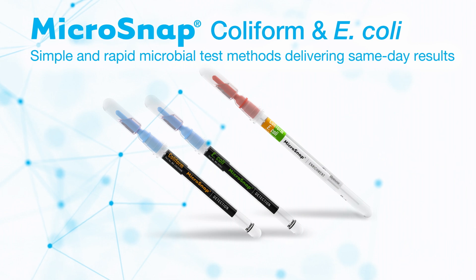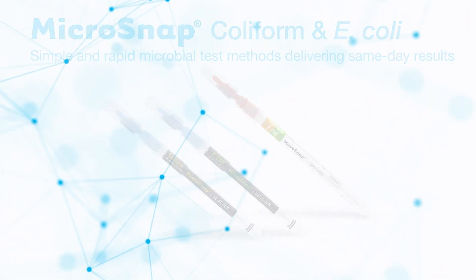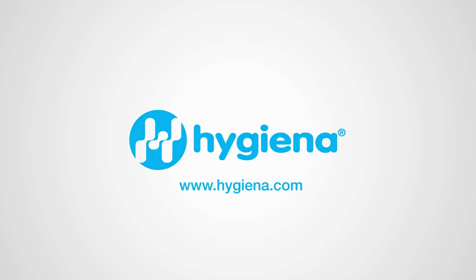Utilize our Microsnap coliform and E. coli products and see how you can dramatically reduce both time to results and time to decision. We hope this video guide has been helpful. Contact our customer support or visit our website to find out more.